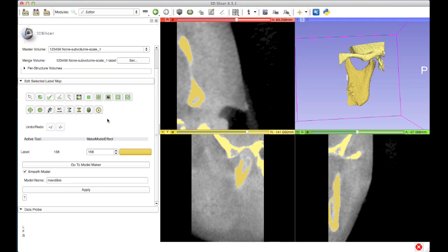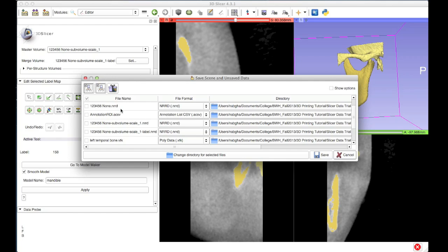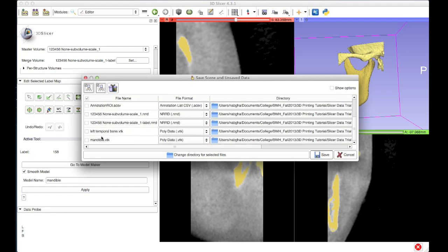In order to do that, I'm going to select save from the toolbar above, as I mentioned at the beginning of the tutorial. You can also select save from the file dropdown menu of Slicer. When I click on this icon, three columns appear in the dialog box. The first lists all the different pieces of information that are part of my Slicer interface right now; to the right of that we have the file formats in which I can save that information; and finally the directory where I can save those files. So the first thing here is the cone beam CT itself, then the annotation ROI, then the sub volume that was a result of that cropping, the label map we created in the editor module, and finally the two surface models I need for my 3D printer.